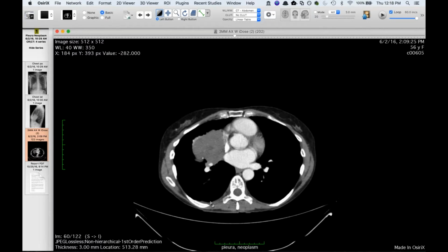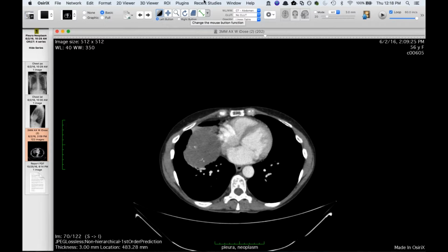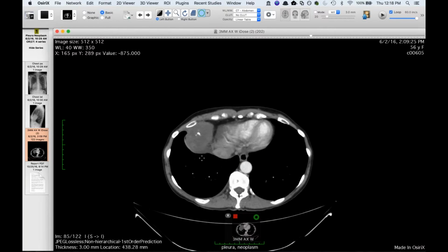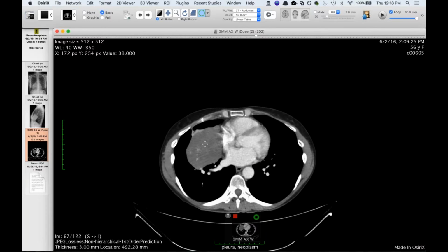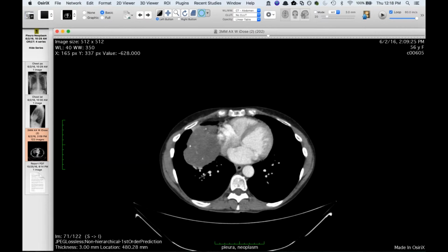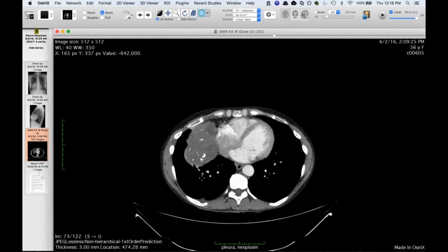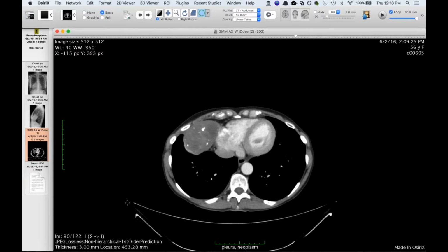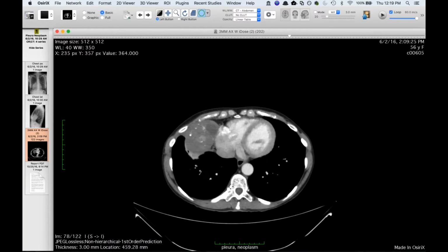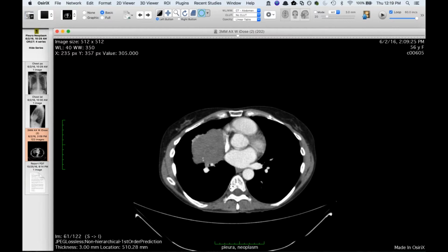What's the attenuation in the matrix of it? Some of this area is 30 to 40, and there are a few areas that are a little bit lower, and then there's some weird linear calcifications through it. You said it's not a fibrous tumor. It's not a teratoma, it's not a hemangioma or lymphangioma. No. It would be unusual for a unicentric Castleman's, but I'm trying to remember if I've ever seen a case that looks like this with the calcium that is a form of unicentric Castleman's disease. But no, that's a stretch.